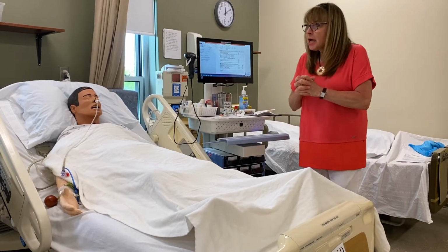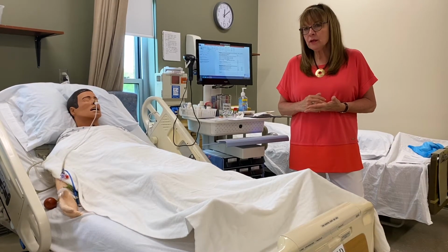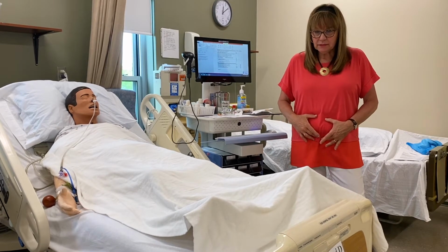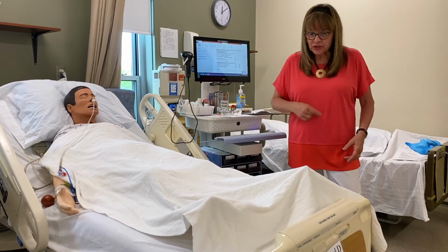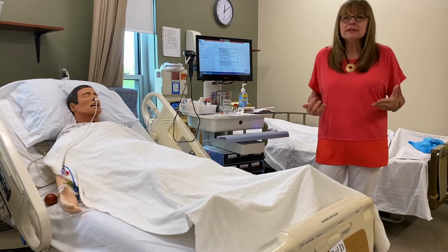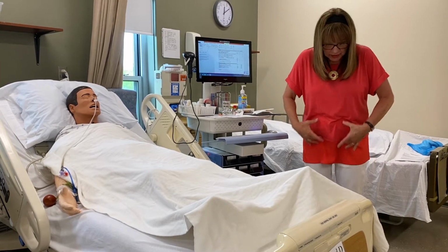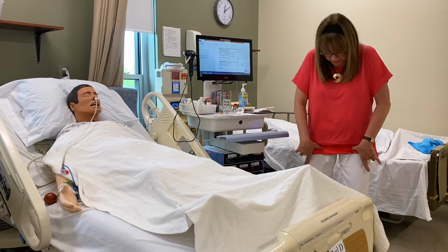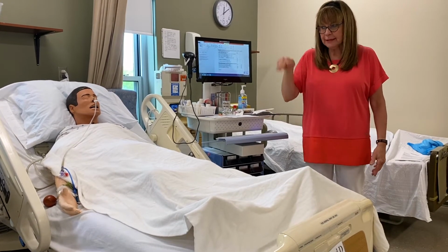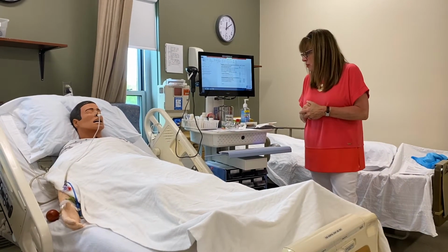angle. When you're giving anticoagulants like heparin or low molecular weight heparin, the studies indicate that they're best absorbed in the abdominal fat 2 inches around the umbilicus. You're going to give a lot of insulin subcutaneously: in the back of the arm, abdominal folds here, anterior thighs where there is some adipose tissue. You need to rotate sites with your insulin so you don't get a thickening of the skin called lipodystrophy.